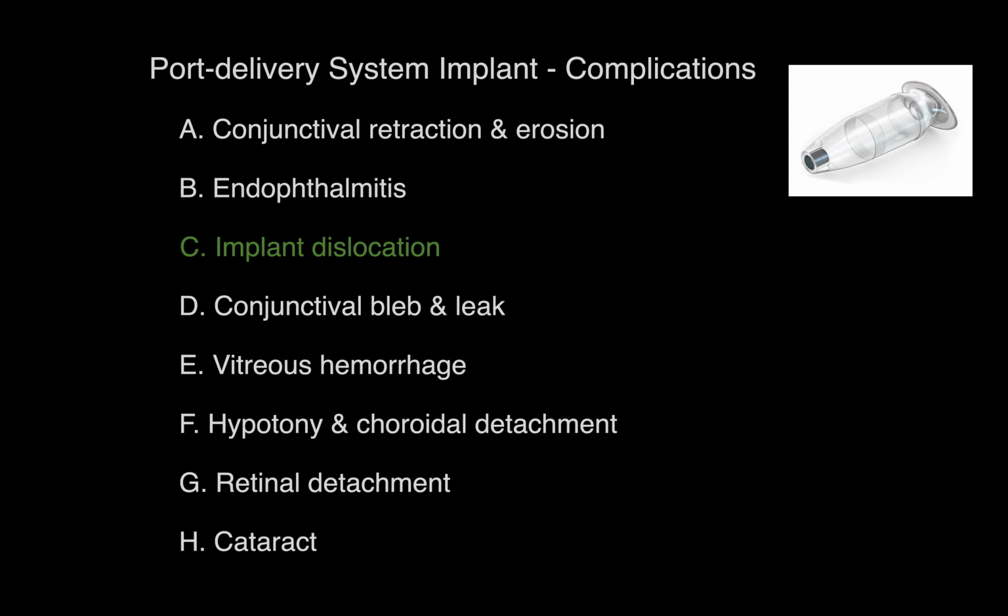Implant dislocation, either external or to the vitreous cavity, concerns a PDS implant that has moved location. Possible causes of dislocation into the vitreous cavity include excessive force applied to the implant during refill exchange, larger than recommended scleral wound, ocular trauma, or eye rubbing.